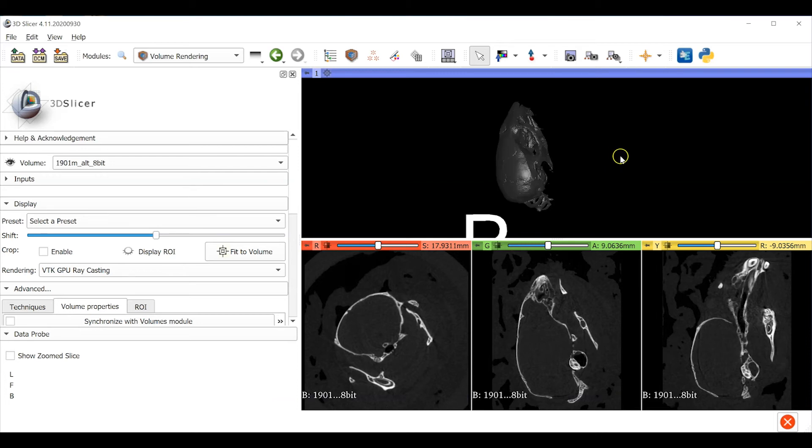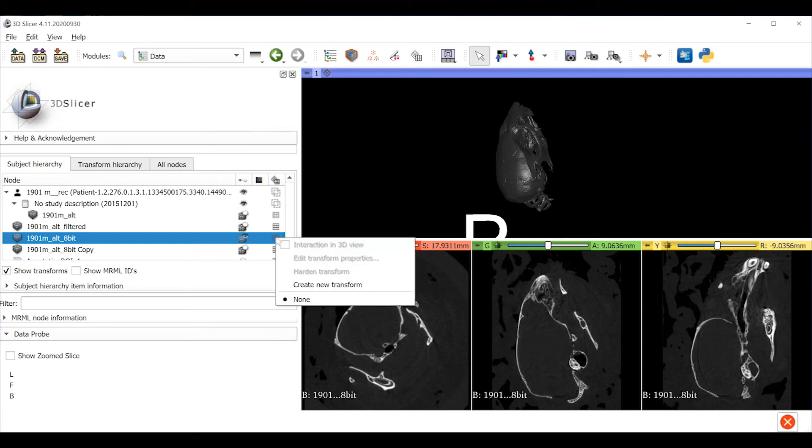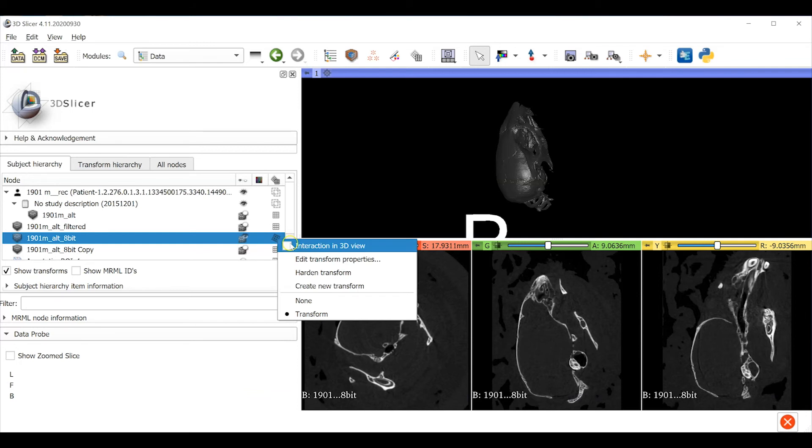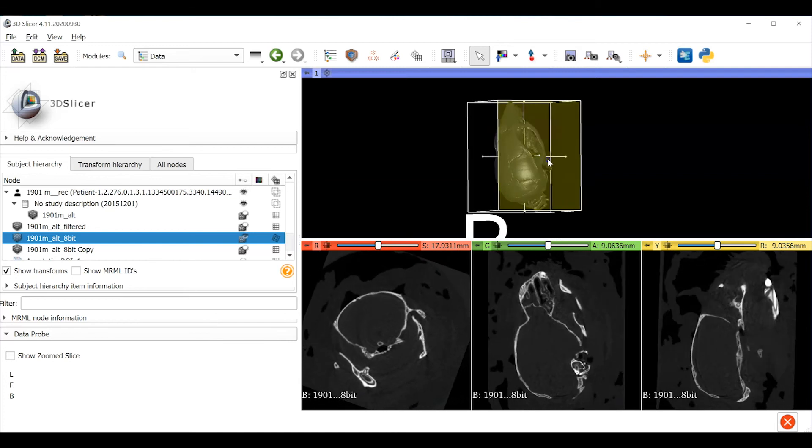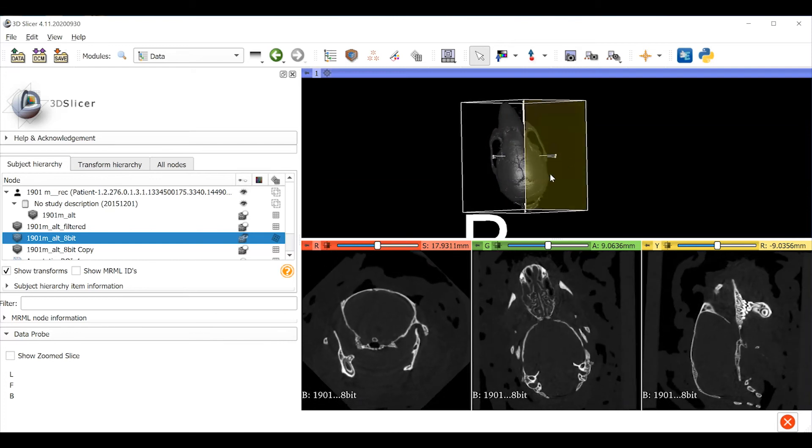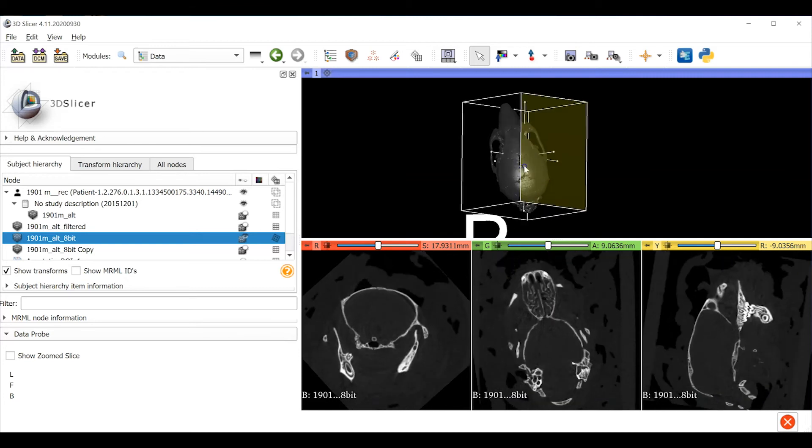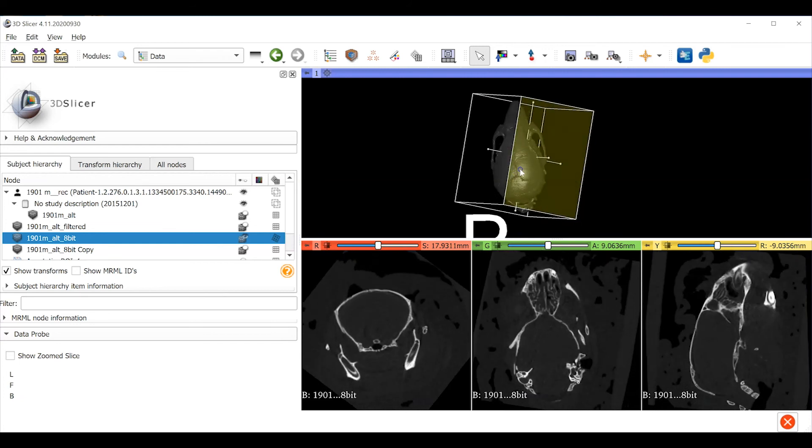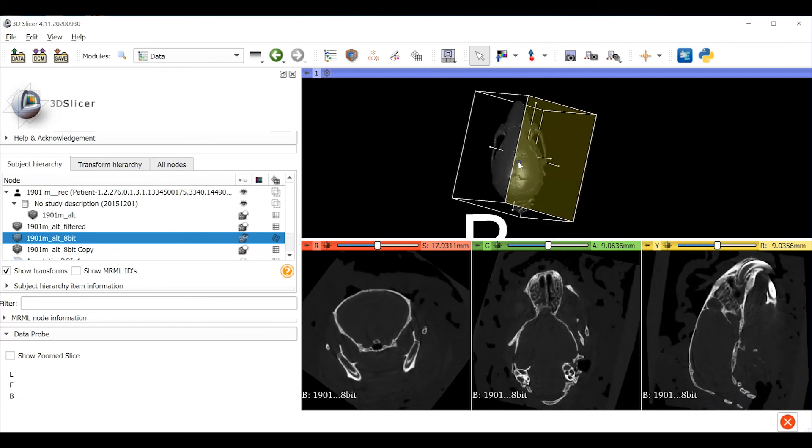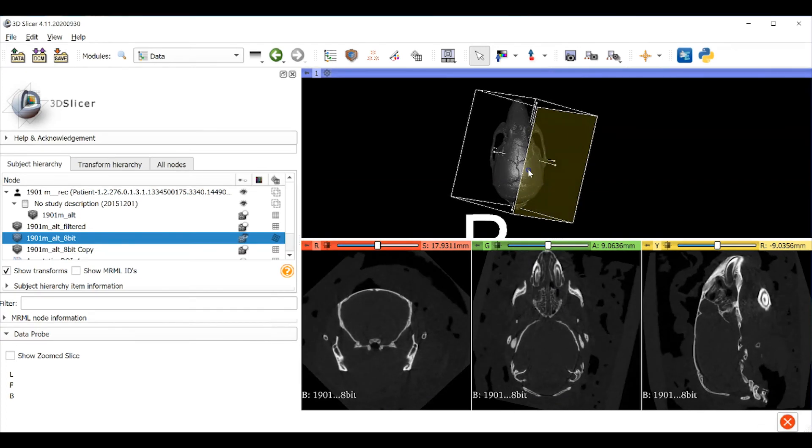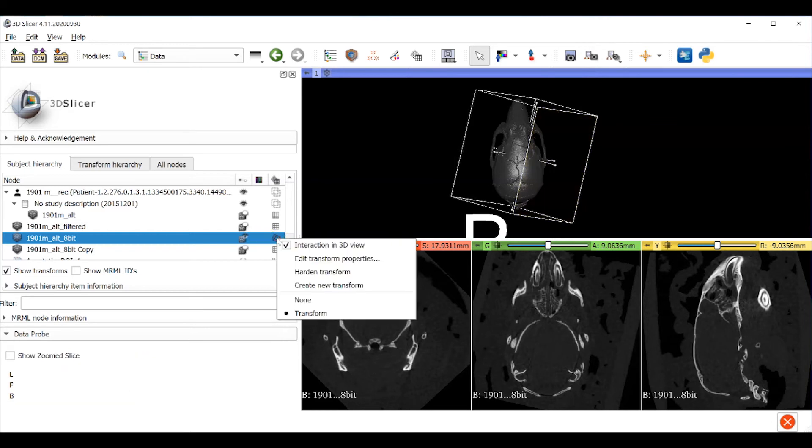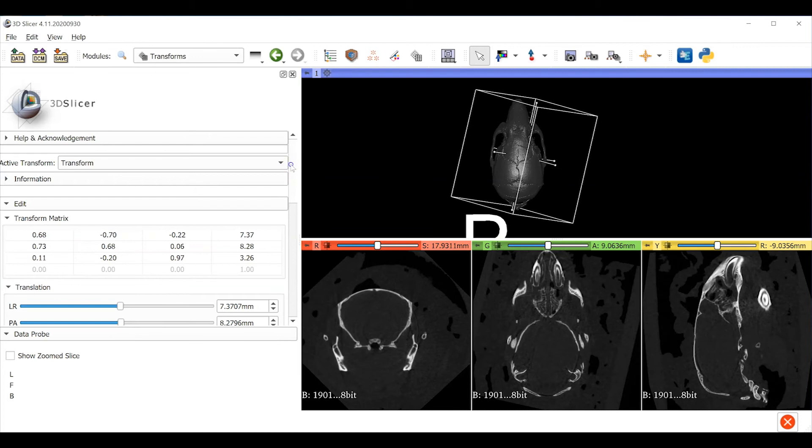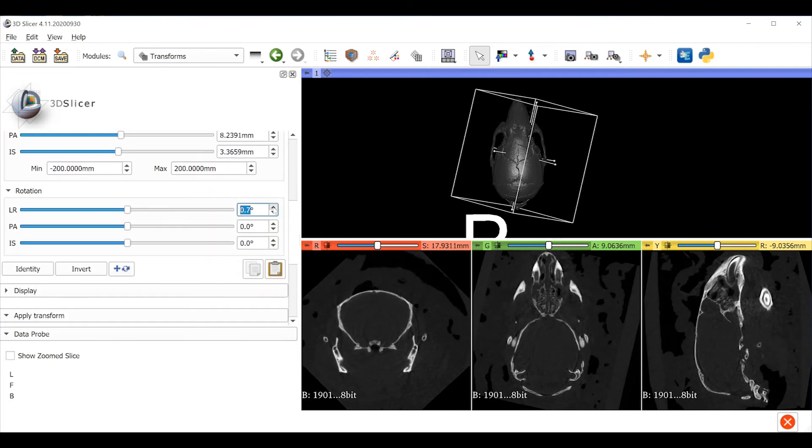Now we'll transform the original 8-bit object just like we did in the first part of this video. Right click on the grid icon to the right of the object name and select create new transform. Right click on the grid icon again and activate interaction in 3D viewer. We'll rotate the skull to correspond to orthogonal planes but won't really pay attention right now to the expected direction. So for example we're not going to worry that the ventral side of the mouse is facing the direction that the program labels as posterior. I'm making small circles to tilt the model in the opposite direction. And if you'd prefer to edit the transform properties directly you can choose that option when you right click on the grid icon. At the bottom of the window are sliders. Avoid the translation sliders for now but you might find the rotation sliders useful at this point.